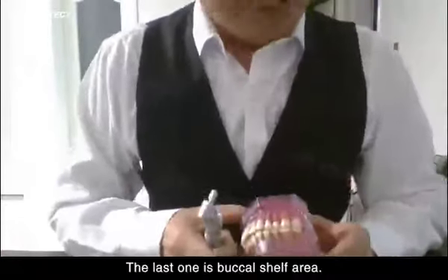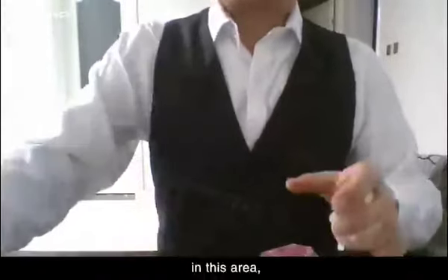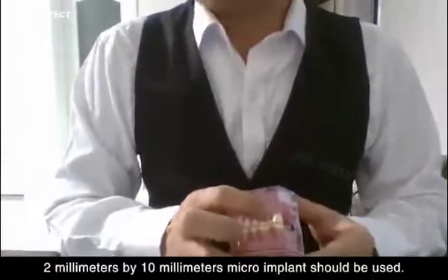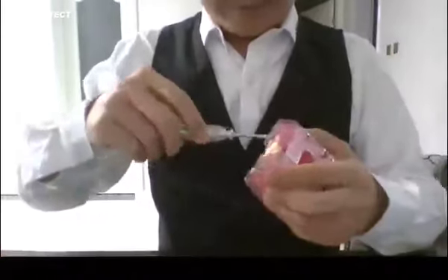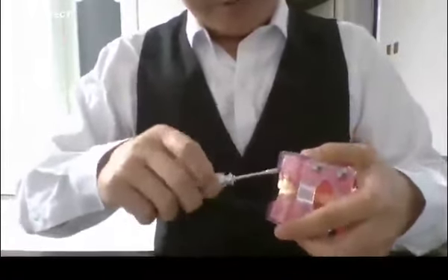The last one is the buccal shelf area. In this area, a 2 mm by 10 mm micro-implant should be used. Let's remove the micro-implant firstly.